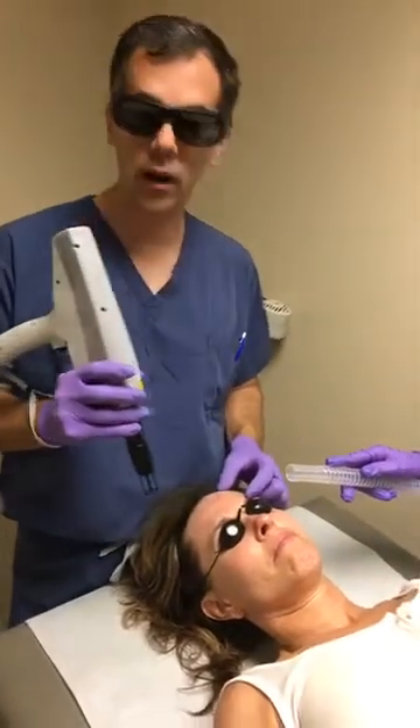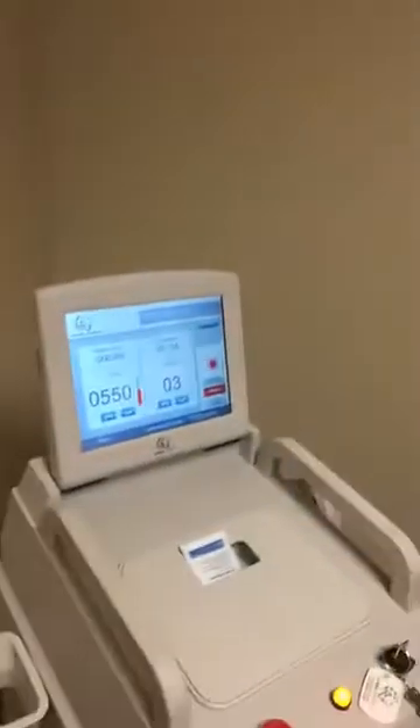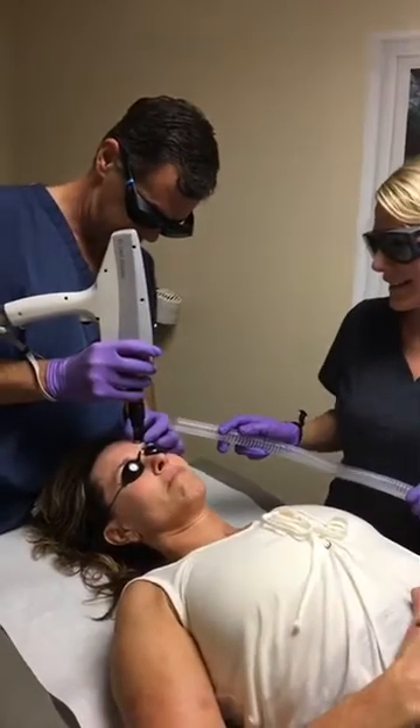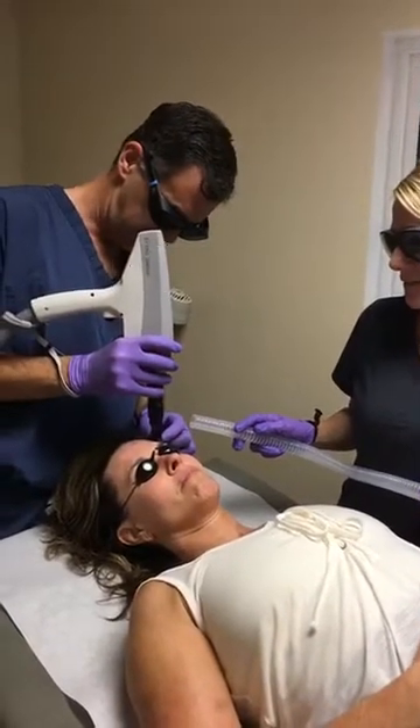Hey Facebook, we are demoing our new Rora Aesthetic Erbium Yag laser. Tracy is getting a full face resurfacing done now. We are really excited to bring this into the practice to be able to offer a resurfacing with minimal downtime. Tracy is really comfortable.